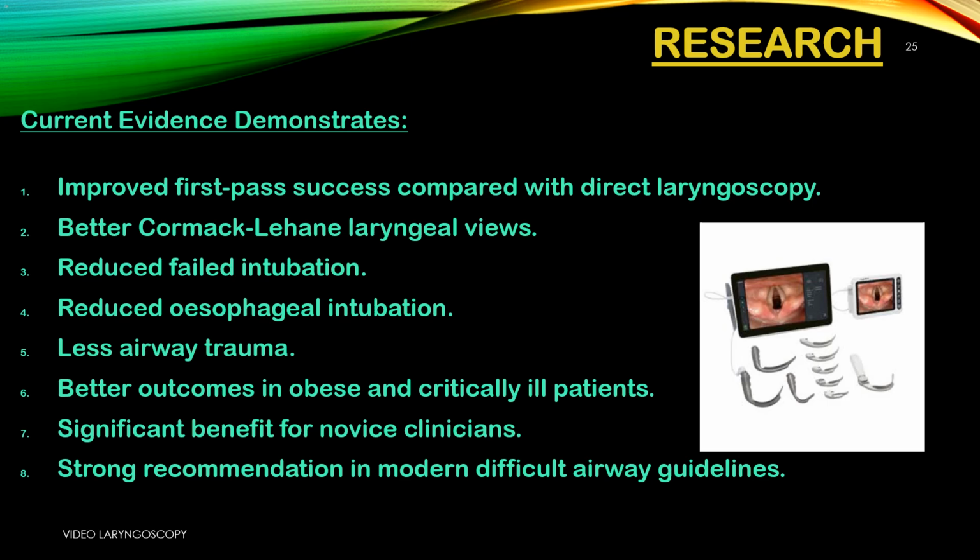6. Better outcomes in obese and critically ill patients. These groups are high risk. Video laryngoscopy gives faster and safer intubation for them. 7. Significant benefit for novice clinicians. Trainees learn faster and succeed more with video. The screen helps them see what to do. 8. Strong recommendation in modern difficult airway guidelines. Major airway societies now recommend video laryngoscopy as first line for anticipated difficult airways.